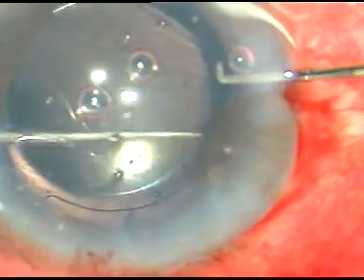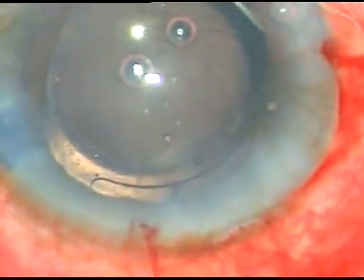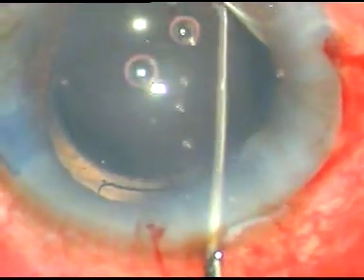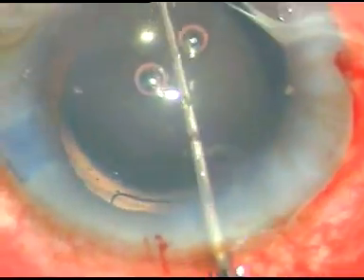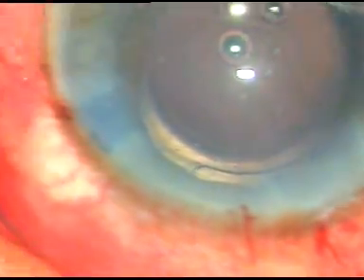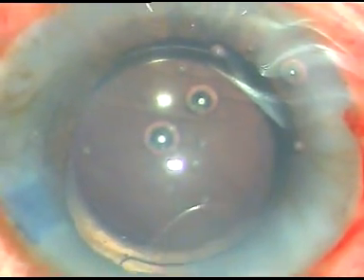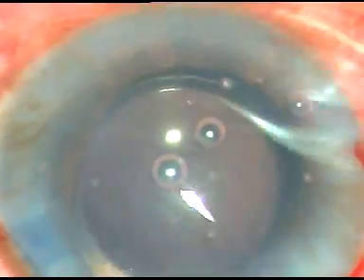I have done clear lens extraction for angle closure glaucoma earlier, about 3-4 cases, and all are doing well. The intraocular pressure becomes normal next day. And now I start removing the viscoelastic substance.